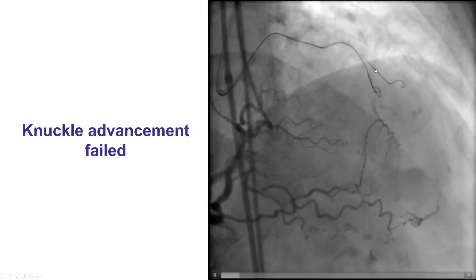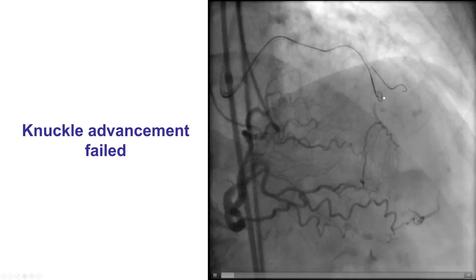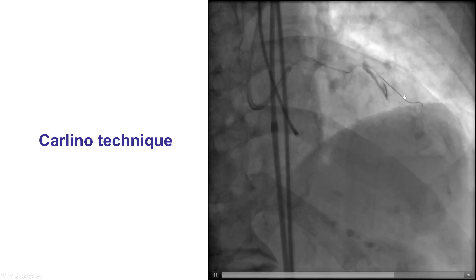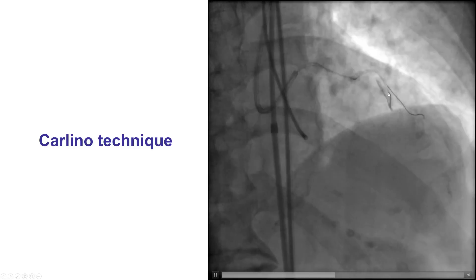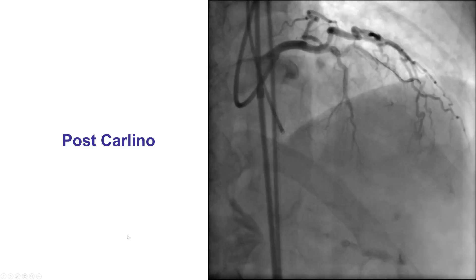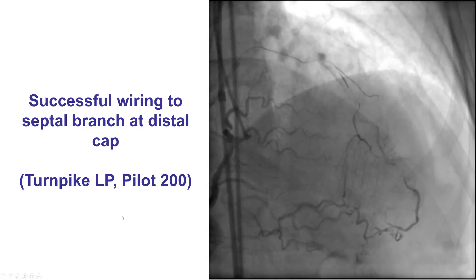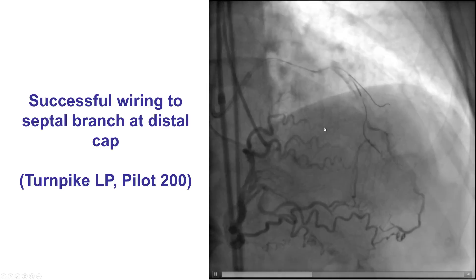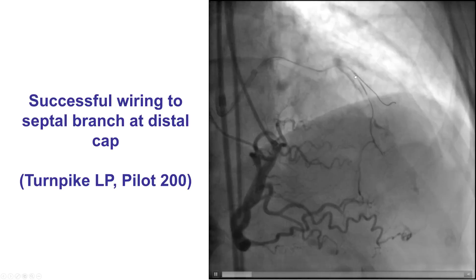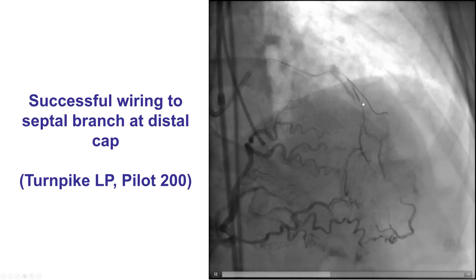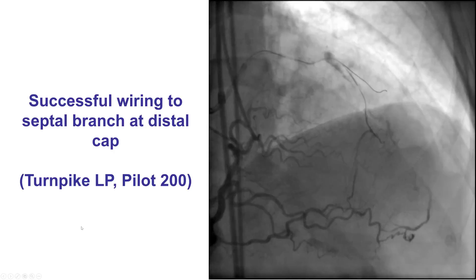This is an example of this technique. The patient had an LAD CTO. We were stuck in the sub-intimal space and could not advance the guide wire more distally. A small amount of contrast was injected through the microcatheter, filling the sub-intimal space. After doing this there was still no significant antegrade flow. However, advancing another Pilot 200 guide wire, the guide wire successfully crossed into the distal true lumen. The Carlino technique modified the distal cap and allowed guide wire crossing.